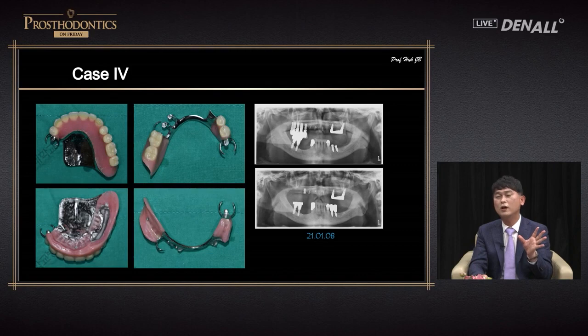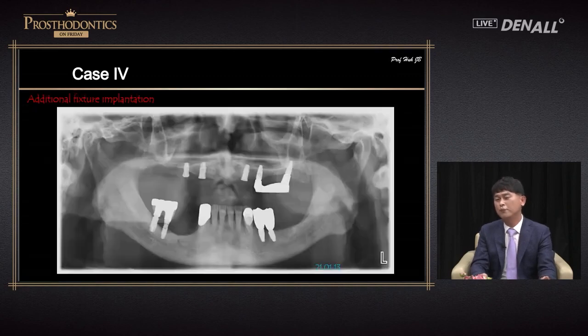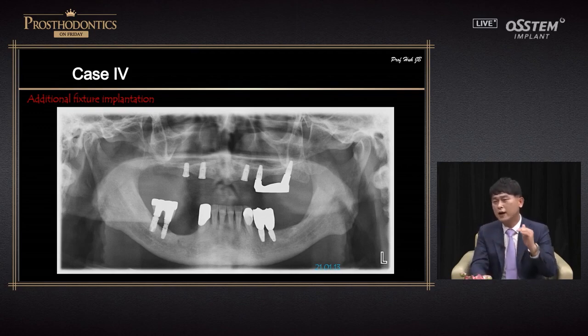Implants should be placed with 1.5 to 3 millimeter distances, but implants were placed too close with each other and that led to peri-implantitis. So I told the oral surgeon, I want to save the bone graft in the upper anterior, so place implants with whatever length or path. That's what I asked, and this is how they placed the implants. The paths look aligned, but they are all in different directions, and the length is 8.5.